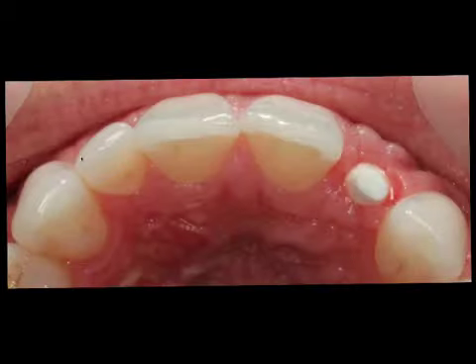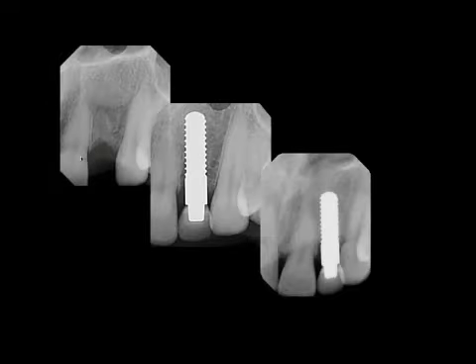This was what the case came back at 3 months. We can see that our flap design allowed me to move some of the keratinized tissue buccally and try to compensate for that initial soft tissue defect. This, on some patients, heals great in about 3-4 months, and on other patients like her, it took much longer, so we see the scarring still evident at the 3-month mark. This is comparing the radiographs before surgery, at surgery, and 3 months of healing. Again, very, very little bone remodeling, if any.